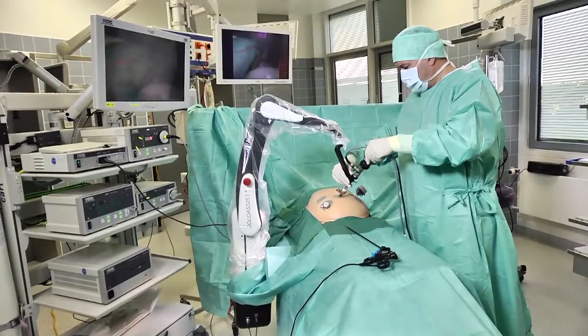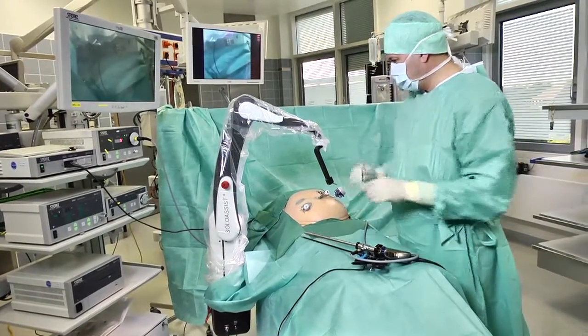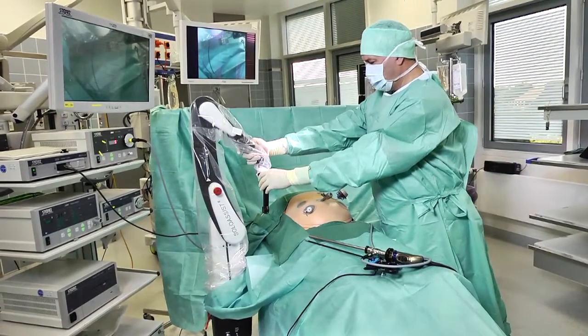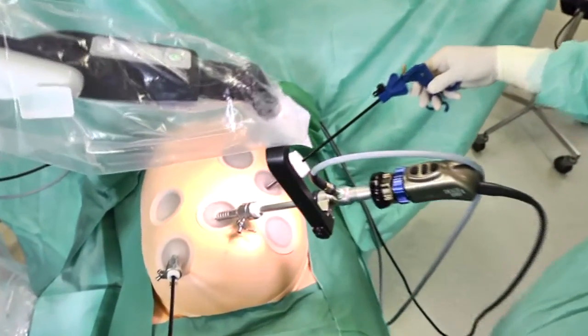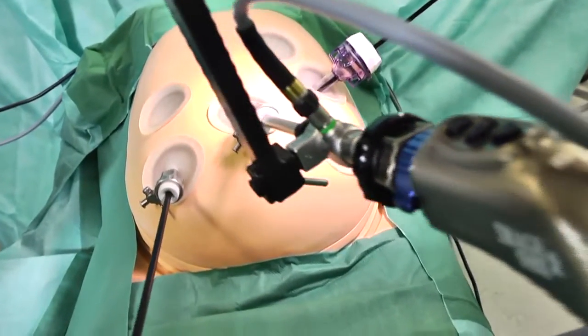Once surgery is completed, the surgeon first disconnects the endoscope from the universal joint. A mere push of a button is sufficient to return the Solo Assist to its home position next to the operating table. Solo Assist, made by Actormed — a reliable companion which has already proved its worth in several thousand surgical interventions.